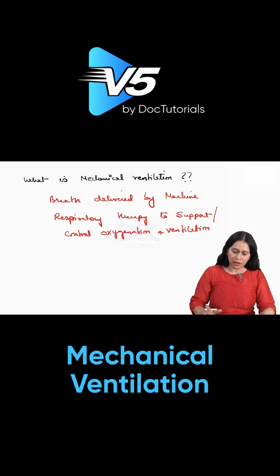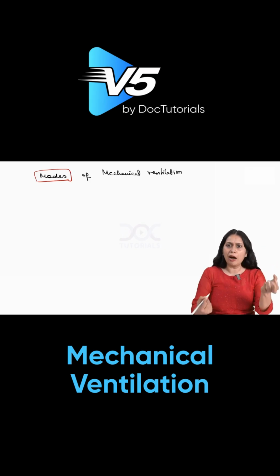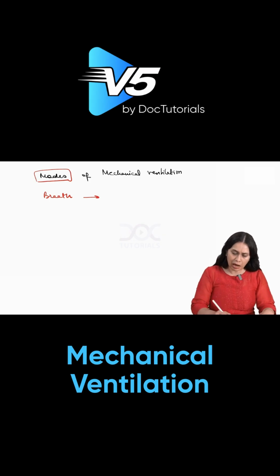Got my point? Okay, so how would this breath be delivered to the patient? It depends upon the mode of mechanical ventilation. So to understand the mode and how we select the mode, we need to understand what defines a mechanical breath. So a mechanical breath is defined by how it gets triggered. So how is the mechanical breath triggered? A mechanical breath can be triggered by machine, that is time triggered, or it would be triggered by patient, that is patient triggered.